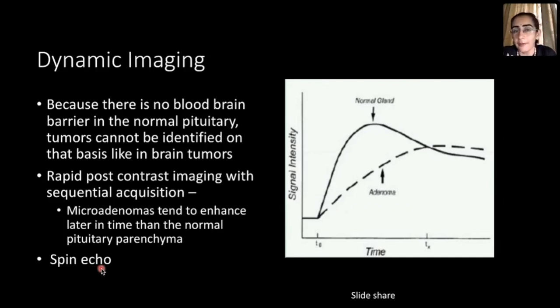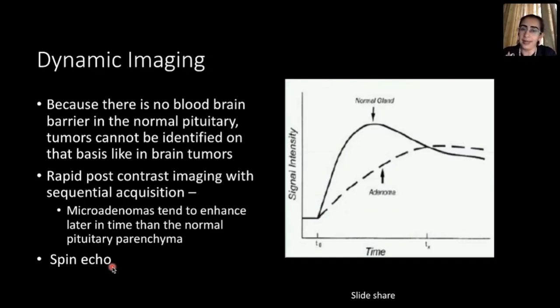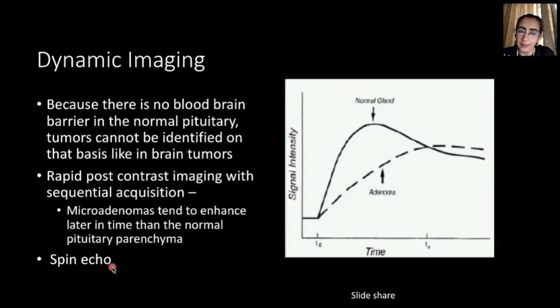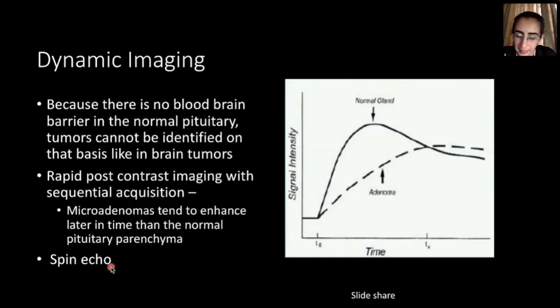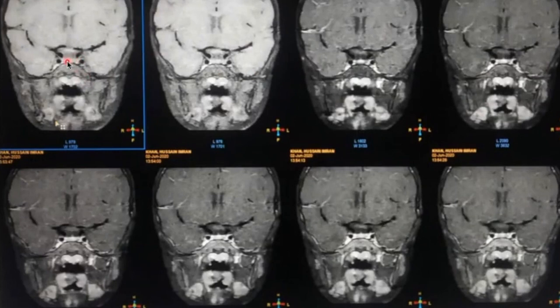Note: the dynamic sequence is not needed for obvious large bulky sellar-suprasellar masses. It is only required when a pituitary microadenoma is suspected and the scan appears relatively normal. The spoiled GRE (SPGR) sequence is used; contrast is injected as a rapid bolus, preferably using a pressure injector, and multiple acquisitions are obtained to generate a time-intensity curve. We observe how contrast initially enhances the central part of the gland and then spreads peripherally over time.